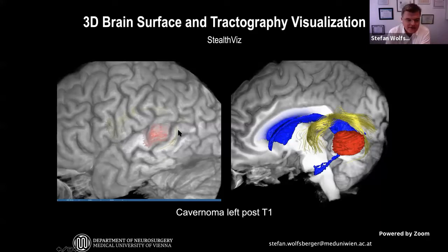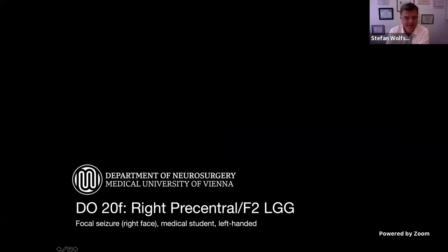And this was the first time we tried to superimpose the arcuate fascicle underneath a translucent brain surface, and see how nicely you can see the piercing of the fibers into Broca's area. I mean, this is really like an anatomic preparation, isn't it? Piercing in Broca's area here, even some fibers to Geschwind's area, and here fibers to Wernicke's area. And you see very nicely how the arcuate fascicle rounds the ventricular system.